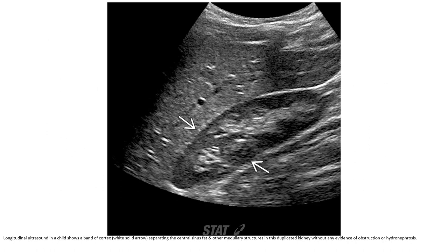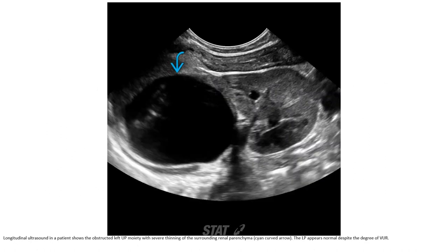This is the ultrasound in a child showing a band of cortex separating the central sinus fat and medullary structures in this duplicated kidney, without any evidence of obstruction or hydronephrosis. This is another ultrasound in a patient showing an obstructed left upper pole moiety with severe thinning of the surrounding renal cortex. The lower pole appears normal despite the degree of upper pole dilatation.